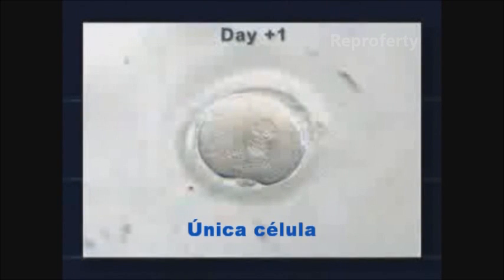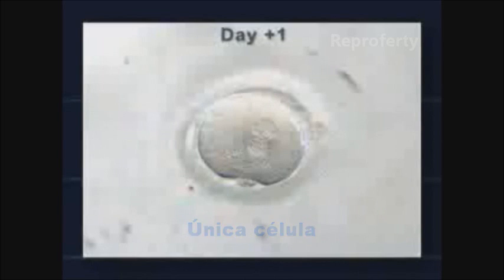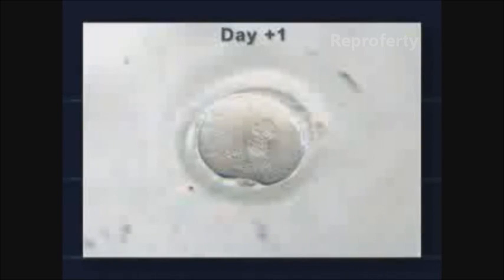One day after fertilization, the embryos are observed under the microscope. If fertilization has occurred, a single cell is seen containing two nuclei, male and female.